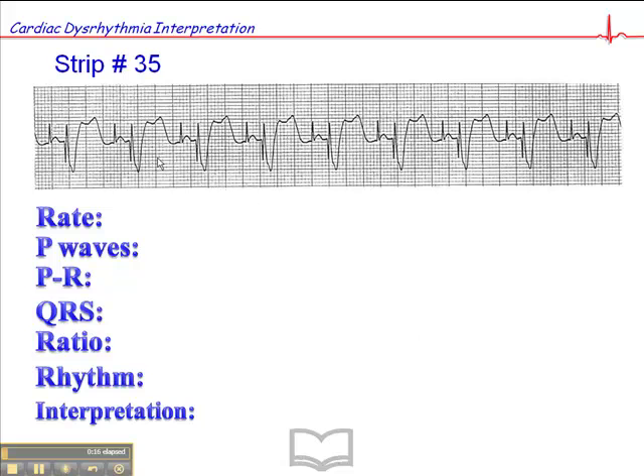Let's start out with the basics — start with the heart rate. We have a wide QRS rhythm, and if we look at the distance between QRS complexes, we get a heart rate of about 75. There are P waves present, but they're preceded by pacer spikes, and this is what the pacer spikes look like.